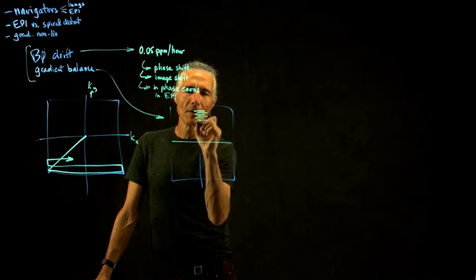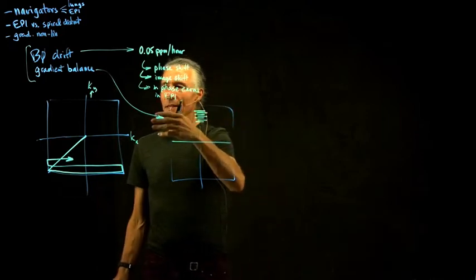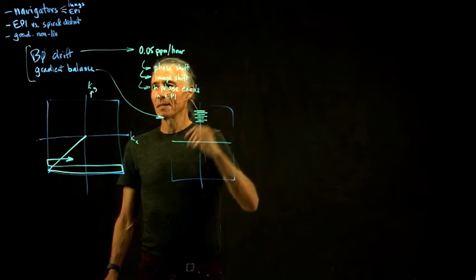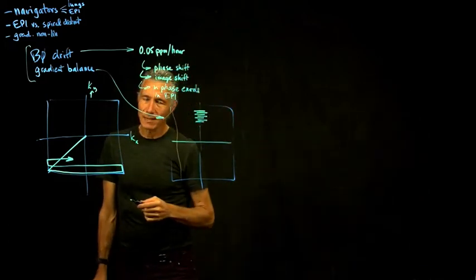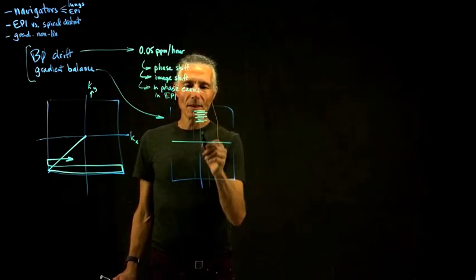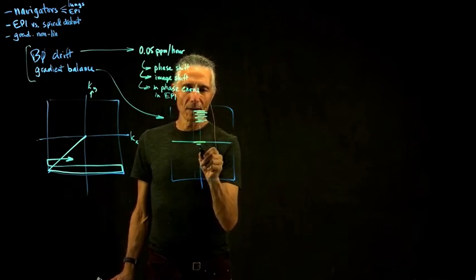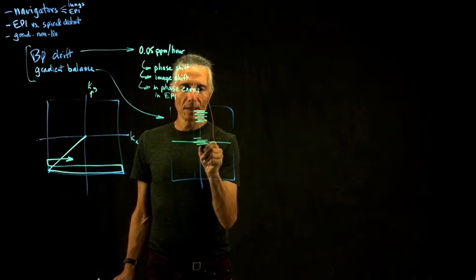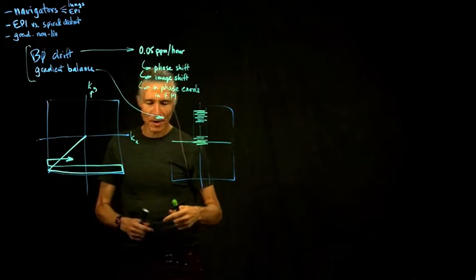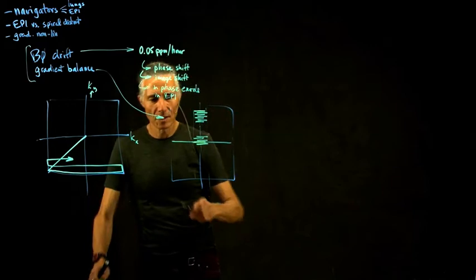So every time you come one way through k-space, it's slightly displaced, which puts you slightly in the wrong part of k-space. If you have that so-called zipper artifact, what is that going to do? That will cause a very large ghost.